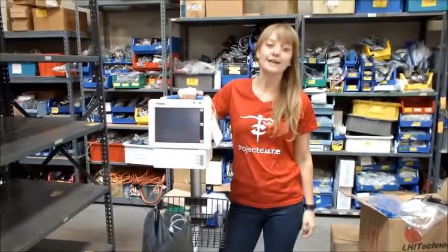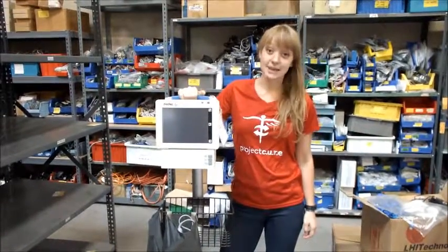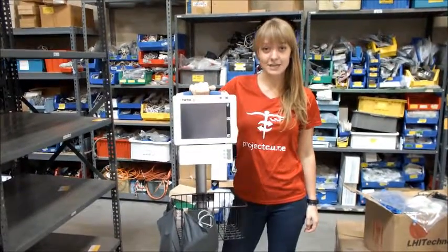Hi everyone, my name is Emily and I'm an intern at Project Cure. Today I'll be showing you how to test and prepare an EKG machine.